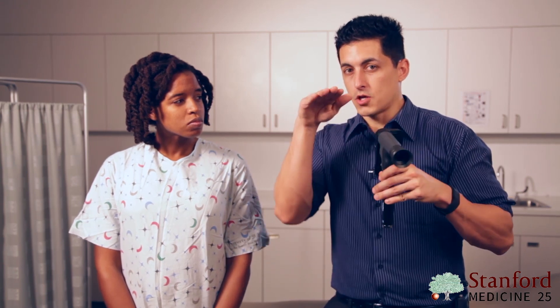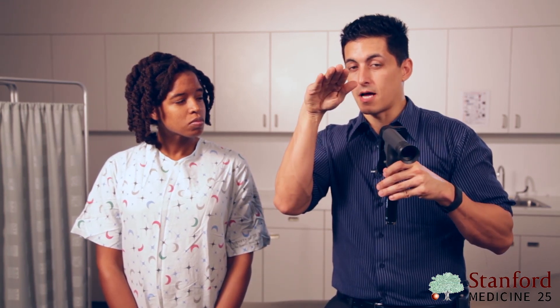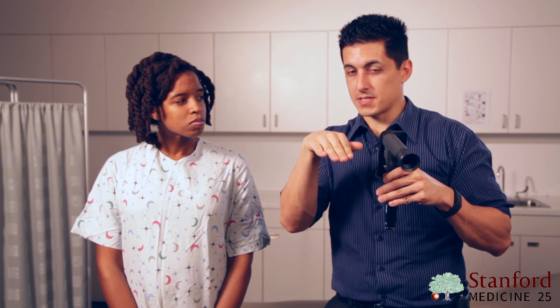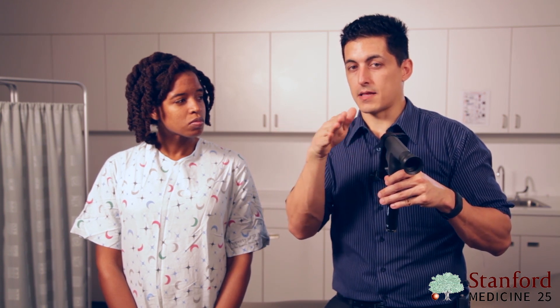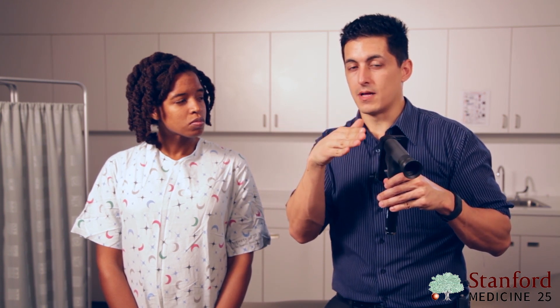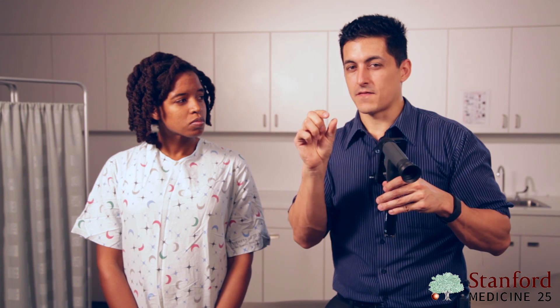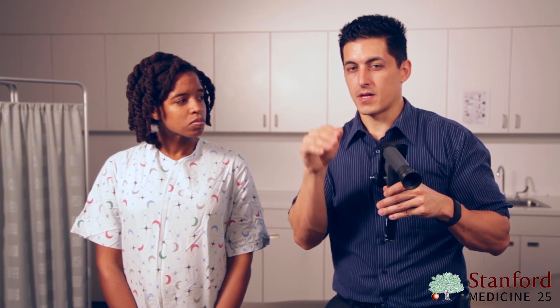If you want to visualize other aspects of the retina with the panoptic, simply have the patient look a little bit up to see up, down to see down, medial to see medial, and lateral to see lateral. Lastly, if you're trying to visualize the fovea or macula, have them look directly at the light.